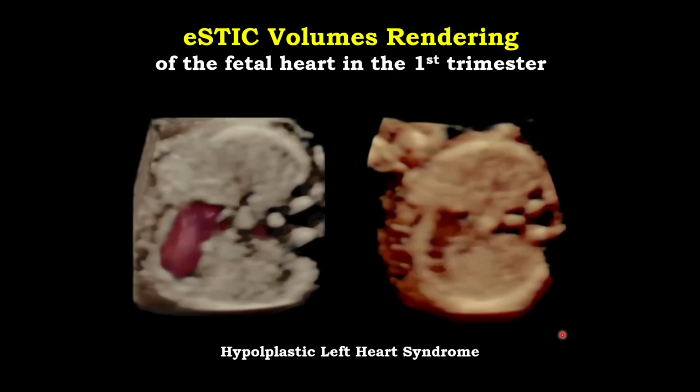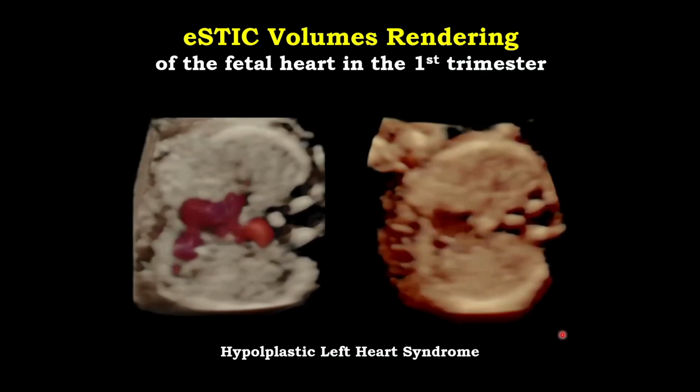2 embryos were transferred, and only 1 baby. We were able to see that it's a singleton pregnancy, and of course we did our best to look at this baby from head to toe at 12 weeks gestation, and this is the cardiac anomaly that we detected.